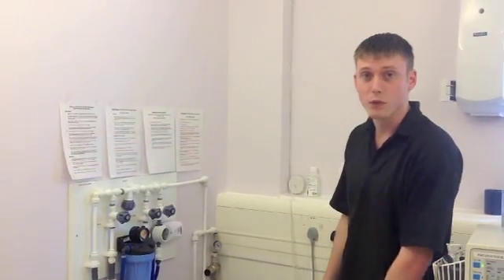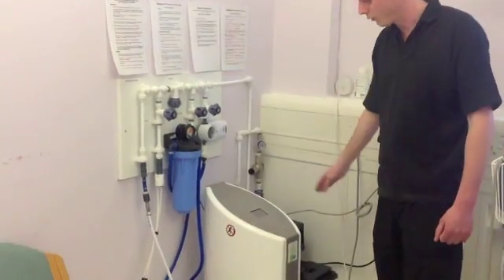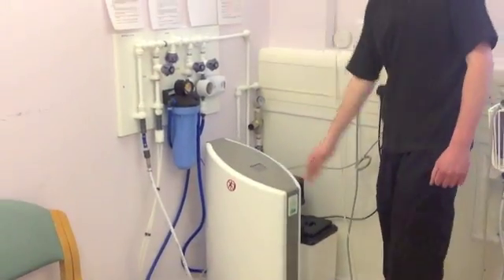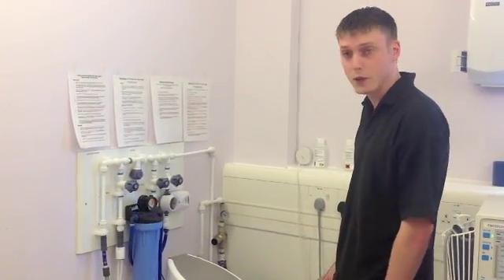Hello, my name is Steve. I am a renal technician and I am just going to explain to you today the valve board assembly, the softener and the RO, just as a recap for people who may have forgotten a couple of bits about it.